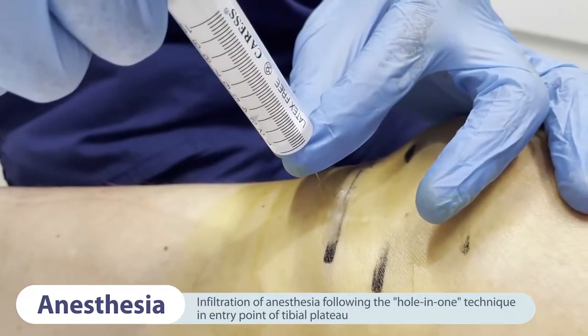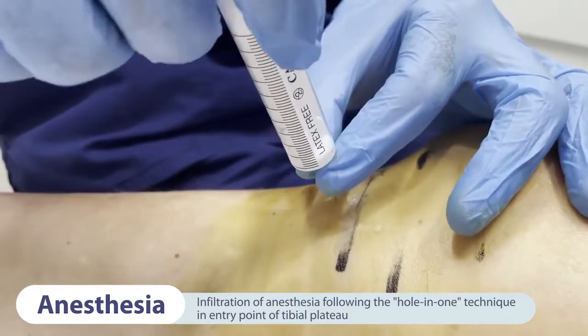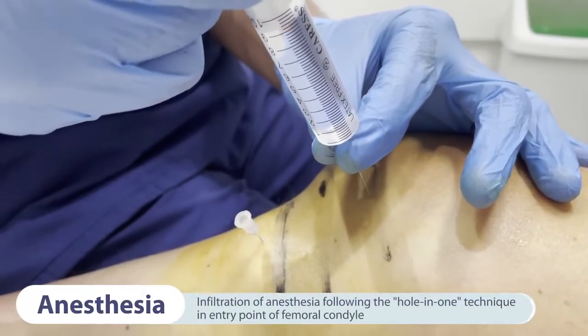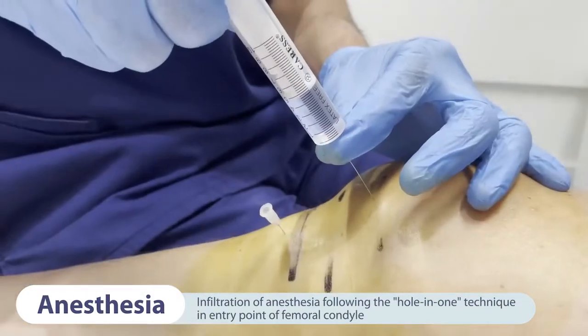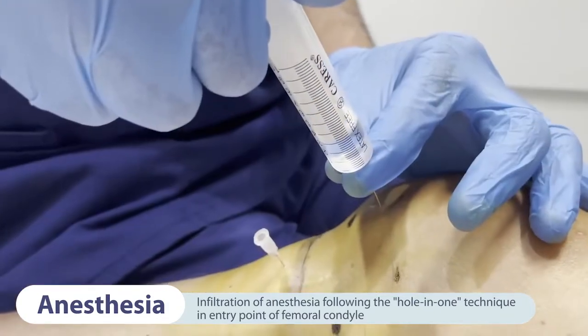We inject another 3-4 millilitres deeper with each piercing until making contact with the periosteum, where we deliver another 2 millilitres. Similarly, the infiltration of the anesthesia is performed at the femoral condyle entry point, following the same hole-in-one approach as for the tibial plateau.